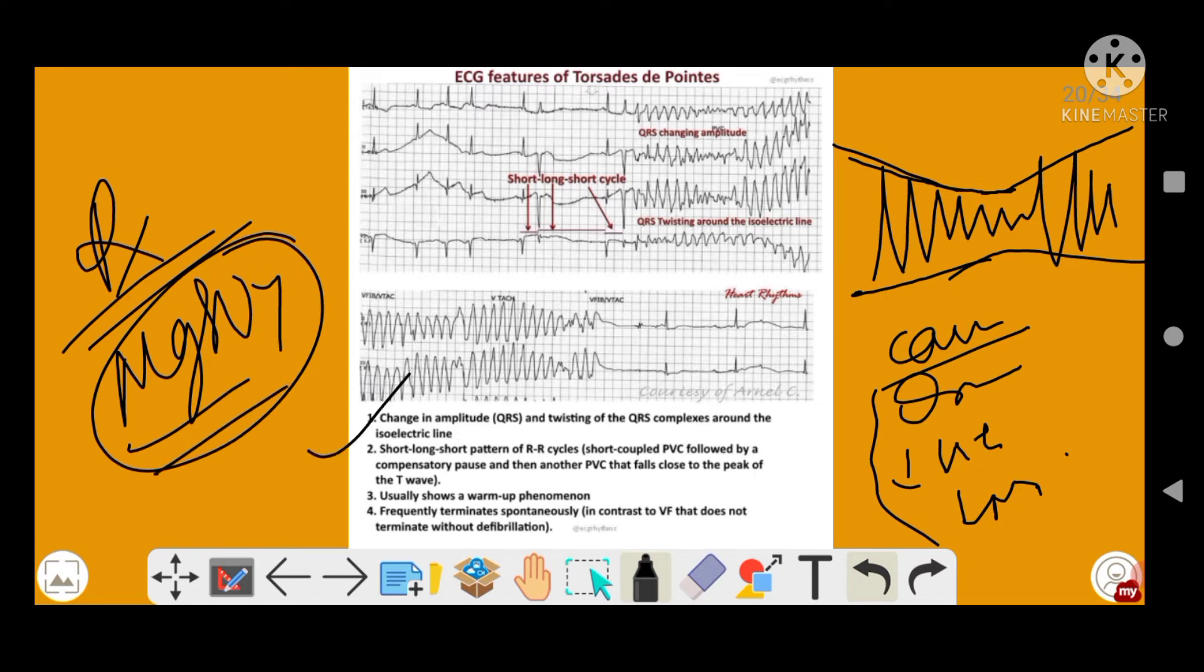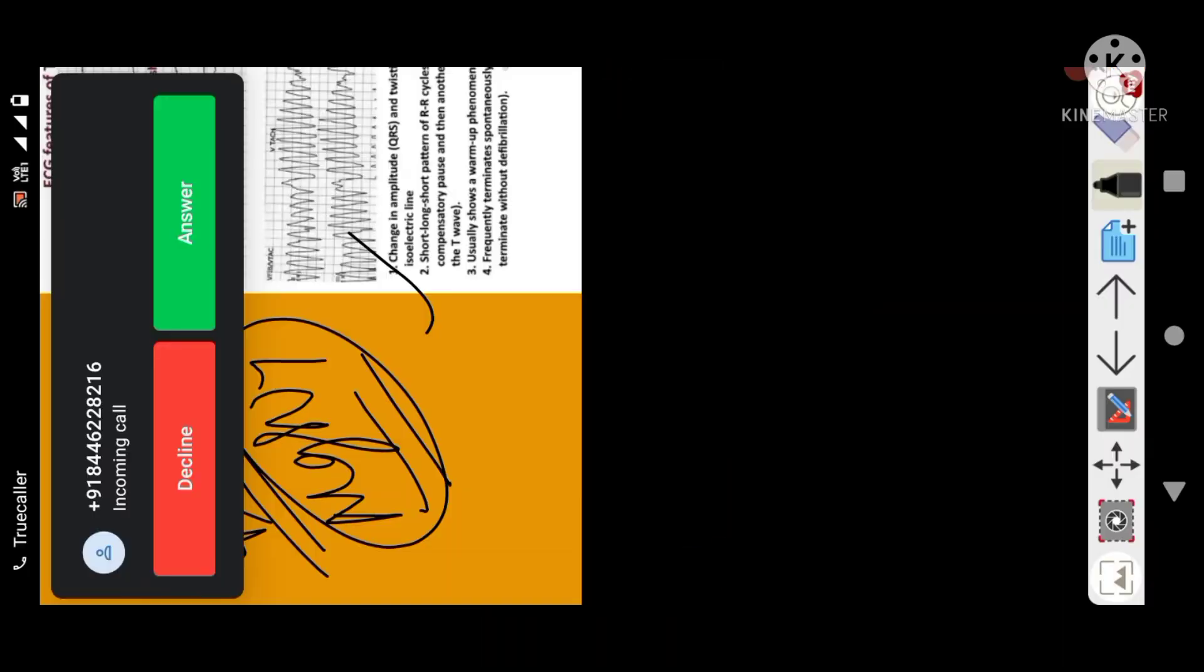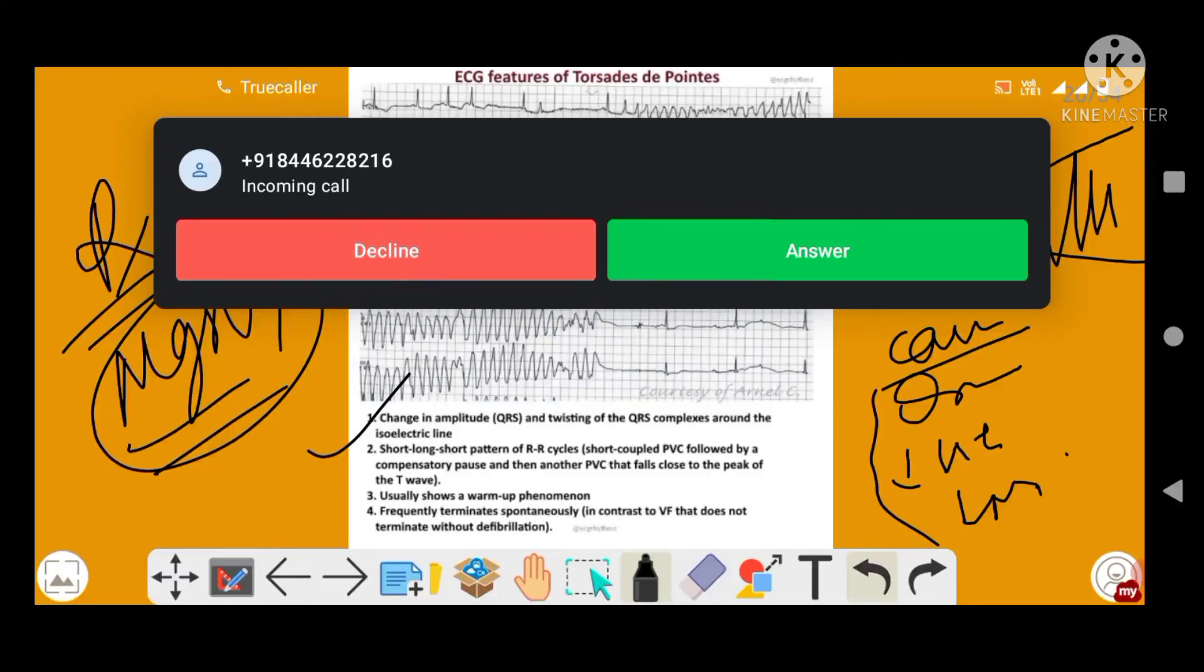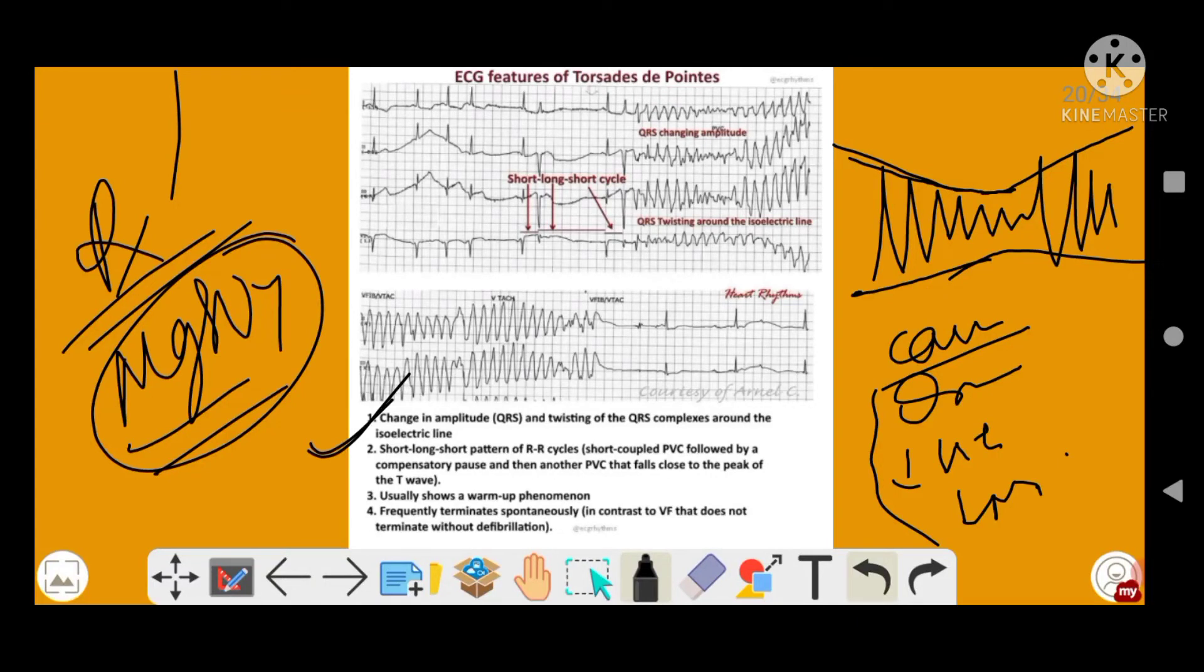So there will be change in amplitude of the QRS and twisting of the QRS complex. See, there is a change in the amplitude of the QRS and twisting of the QRS complex around the isoelectric line. Just see the changing of the amplitude of the QRS and twisting of the QRS complex.